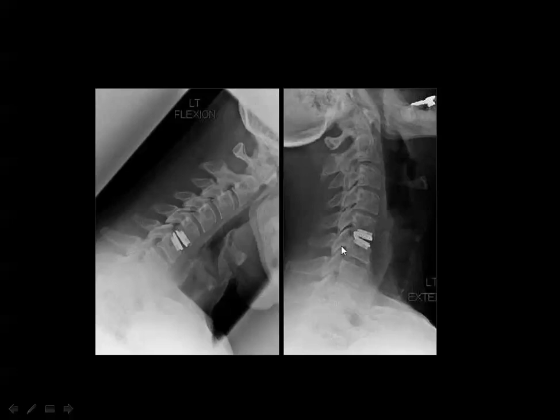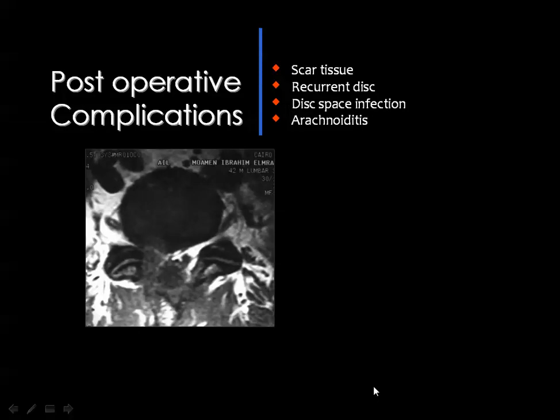They tried here to let the prosthesis move to simulate the original disc, because you know that if you have fixed this level, there is a great chance of having a disc lesion above or below the fixed level. Then they tried to have a disc spacer which can allow some movement at the level of surgery, so that you can prevent the development of disc lesions above or below the level of surgery.